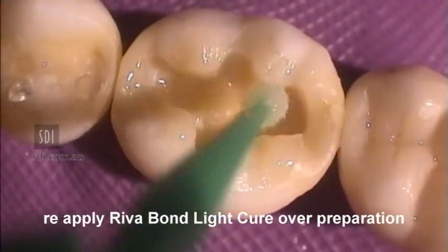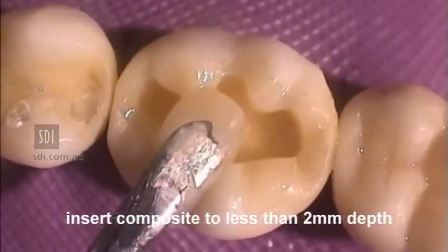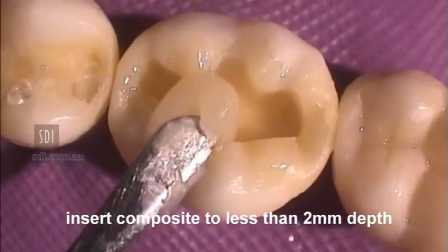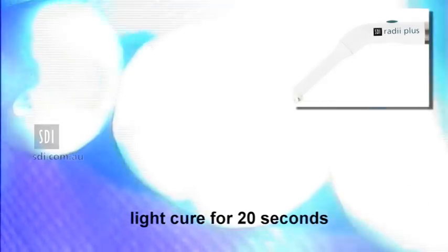Reapply RevaBond LC over the cavity preparation and adjacent enamel surfaces. Insert the composite resin to a depth of less than 2 mm and condense with a suitable plastic instrument. Light cure the restoration.